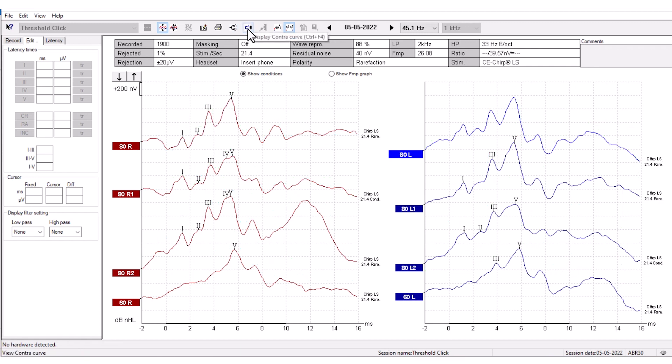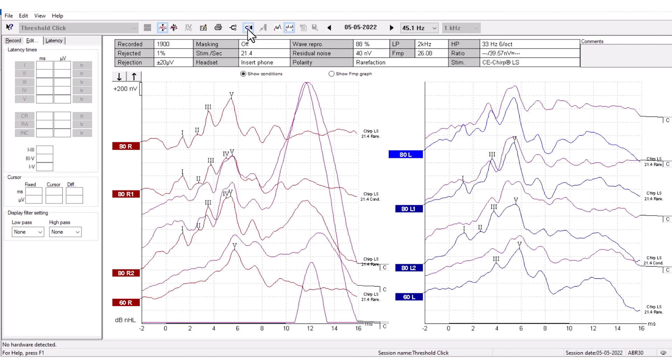This is the display contra curve. When pressed, you can see the contralateral ear response. Click the button again to hide the contra curve.